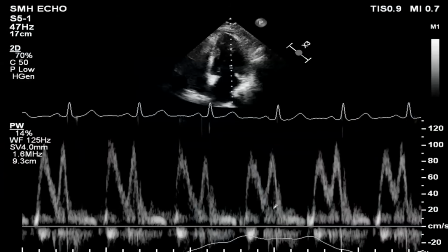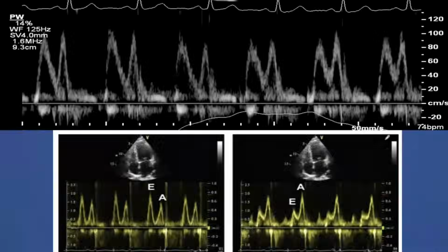No constriction, no tamponade. What do you think? No? This is a common day-to-day patient. So I was told this a long time ago, as a hint. It's not in the books. I haven't seen it anywhere, but I was taught by some of my teachers. Whenever you have variation like that, where the E here is a bit higher and here is even higher, and then it comes back, this is like a Valsalva. When you ask the patient, he is in transition, almost grade 2, grade 1.